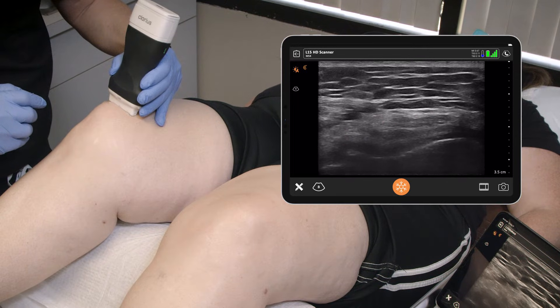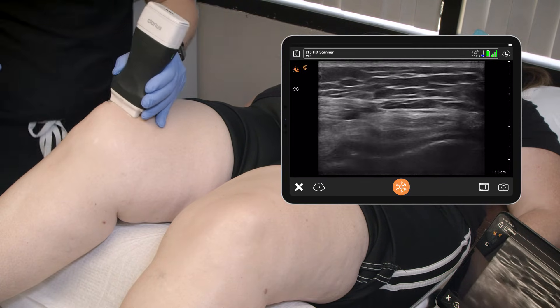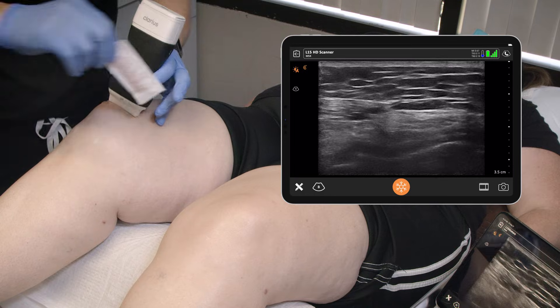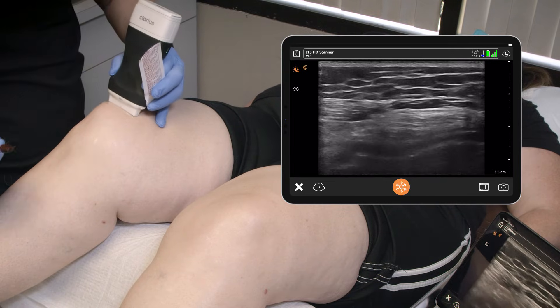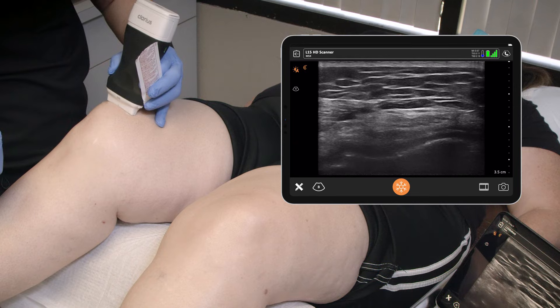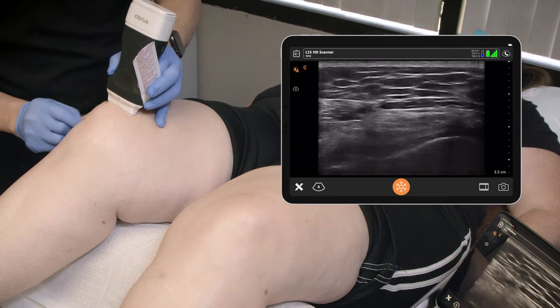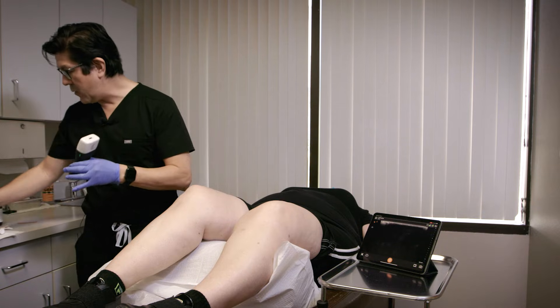So this allows us easy access, but you can see that the access is literally about a millimeter of space to get in. Based off my estimates here, we're looking at roughly about 2.5 centimeters or 2.1 centimeters to get in. So we can identify the specific space that we want to enter to make sure we get into the right spot.